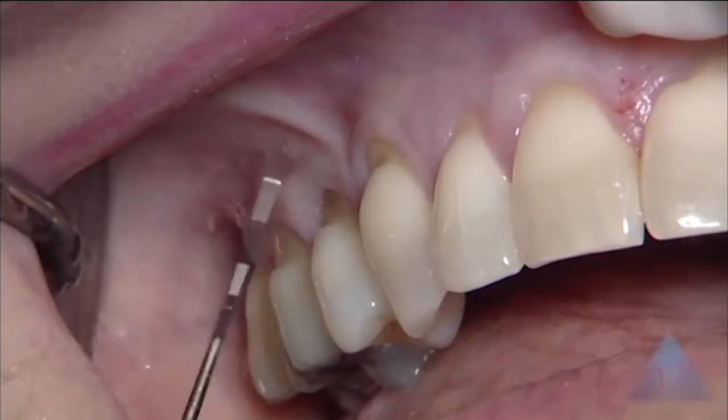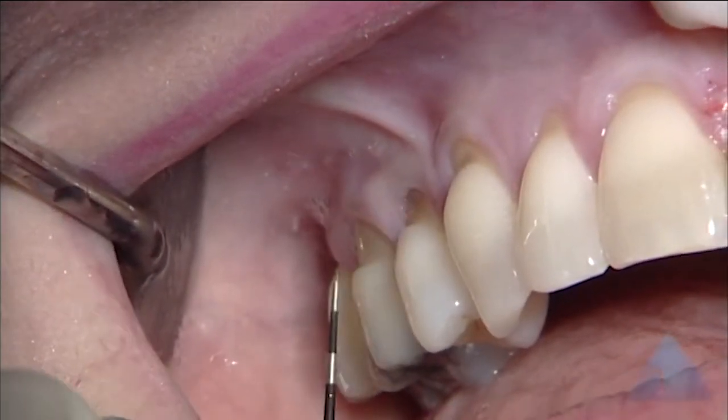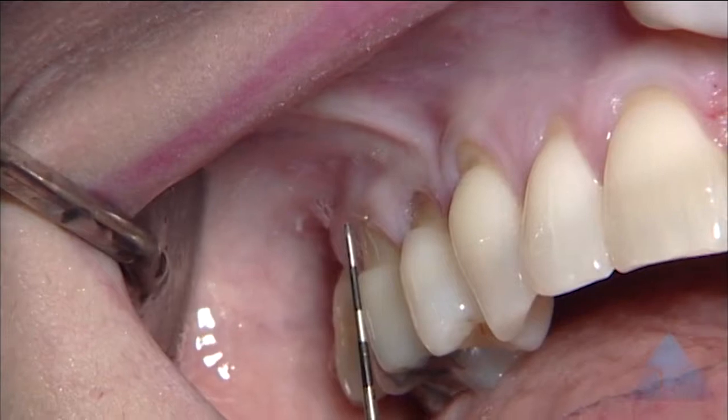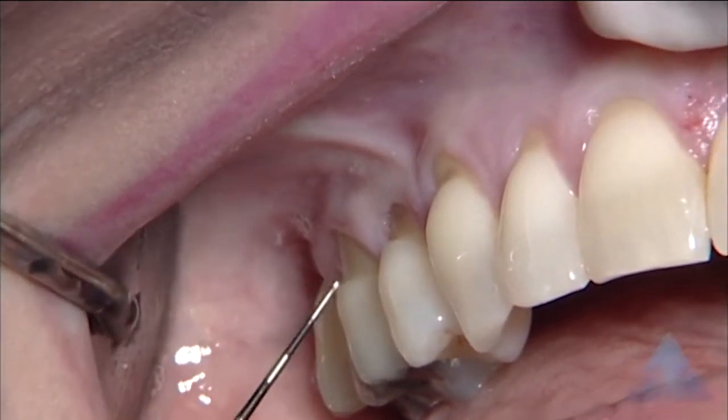There's a missing premolar. We have a little cervical notch here, about three millimeters of recession, and about four millimeters of recession on the molar. Not so much notching there.